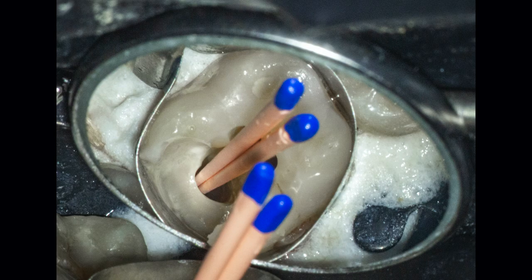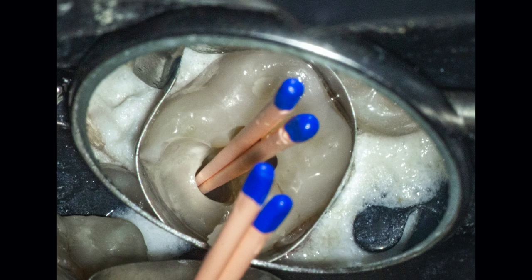In this case, the distal. If you'd like, you can apply some of these cones to the mesial canals as well, but since the material itself will most likely not flow to that area, I'm not going to worry about placing any gutta percha cones there. I'm only interested in blocking out those distal canals.